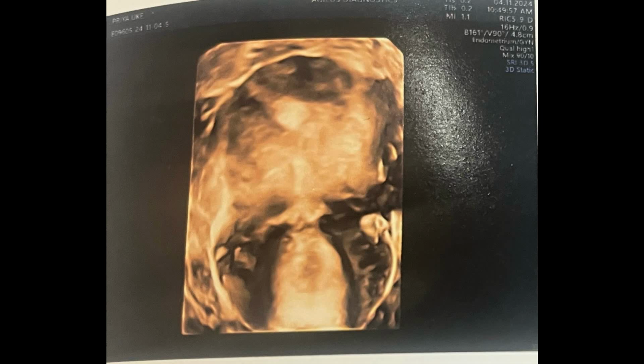I am Dr. Pavan Gulhane and this is a case of Asherman syndrome. She has undergone 3 previous abortions and you can notice this is the area of adhesions at the level of the cervix and in the body of the uterus.